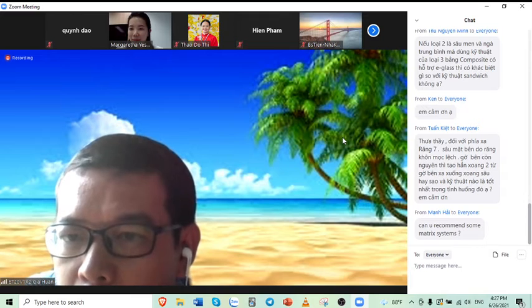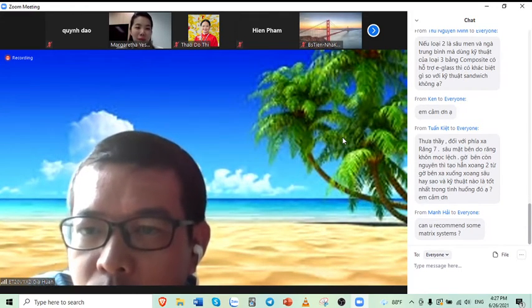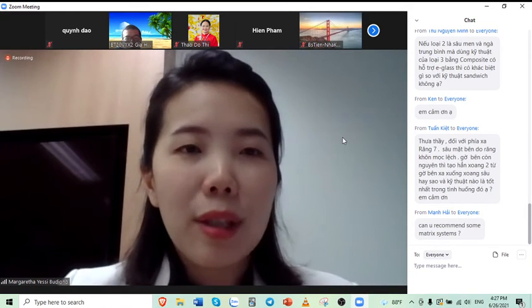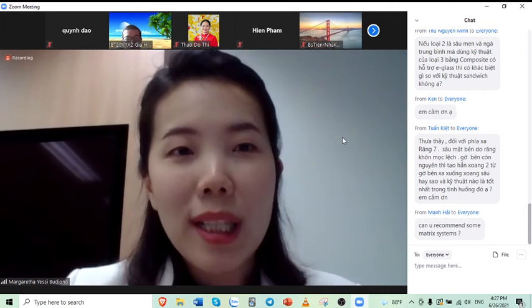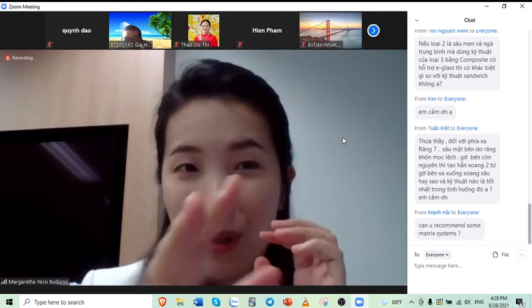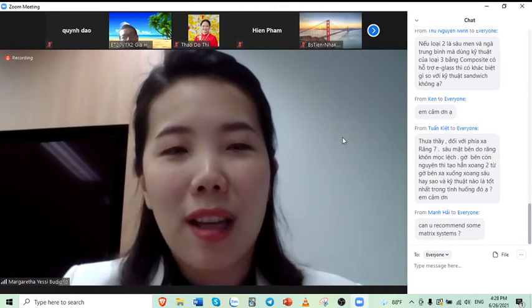The question is, can we use FX flow for the closed sandwich technique? Yes, it's recommended to use FX flow in the closed sandwich technique, because we can't have this FX flow exposed outside, right? So yeah, closed sandwich is perfect for FX flow.